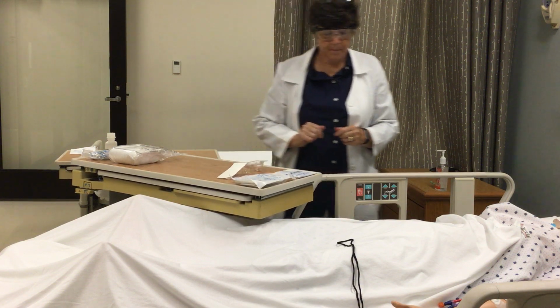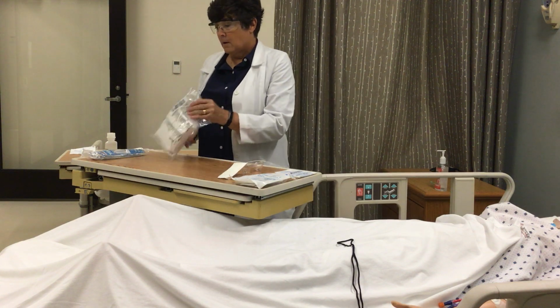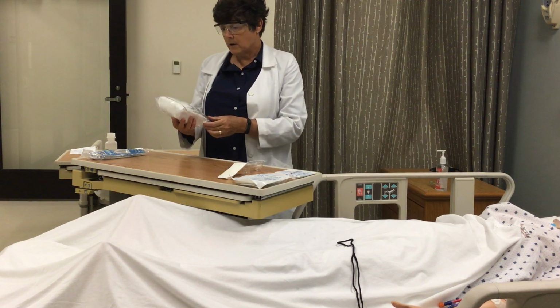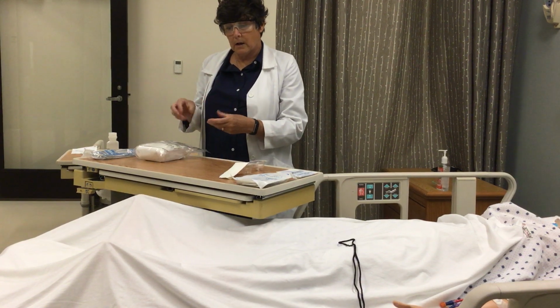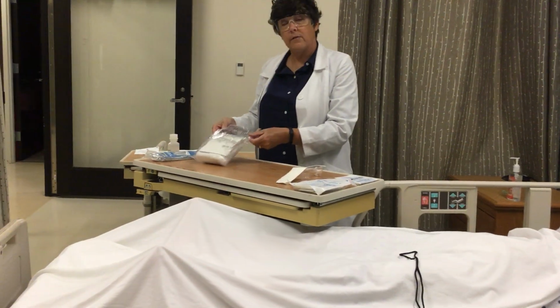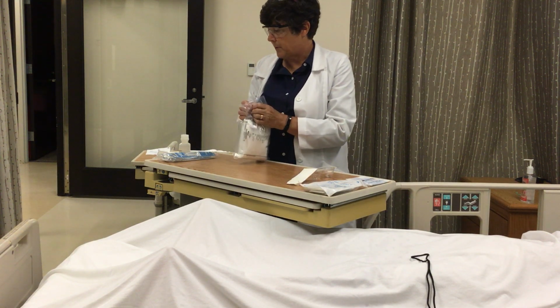Okay. Open the sterile tracheostomy kit. Some facilities use a commercialized tracheostomy kit. Others do it a la carte, where they just get all the items that they feel they'll need for this procedure. Today I will use this prepackaged kit.